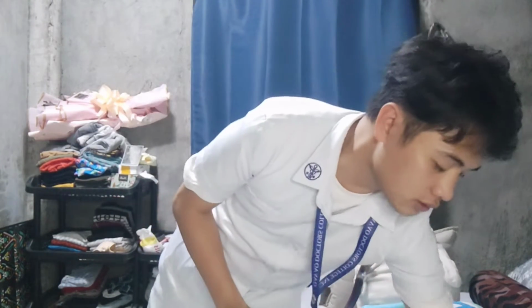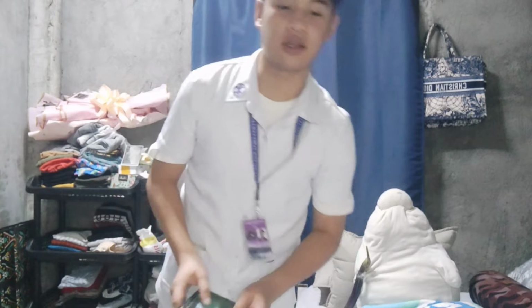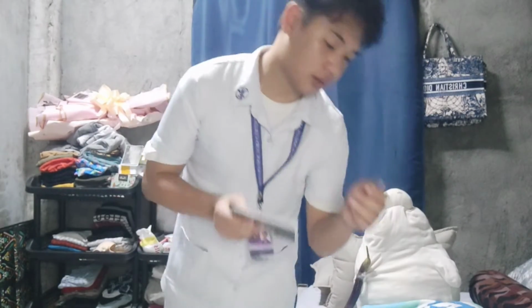So we have here the ampule that we're going to use. We need to follow the three checks for administering medications. We need to read the label of the medication: first, when it is taken from the medication cart; next, before withdrawing the medication; and the third, after withdrawing. We need to ensure that the medication being withdrawn is also the packaging that has the same medication inside. It is much more efficient to recheck every time. So here is the ampule that we're going to use.